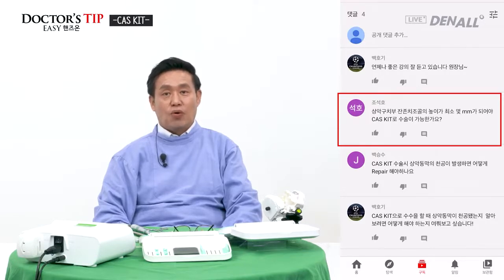If the patient is young and it is free distally and the opposing teeth are healthy, we need to have a long-term perspective. We need to do the bone augmentation. If the residual bone is low, lateral approach can be used for the bone augmentation. Therefore, the height of residual bone cannot be the absolute criteria for lateral or crestal approaches. Various factors need to be considered to make the decision.